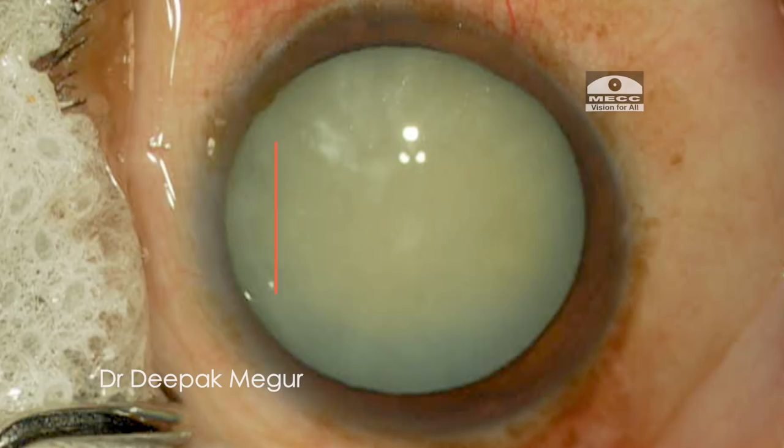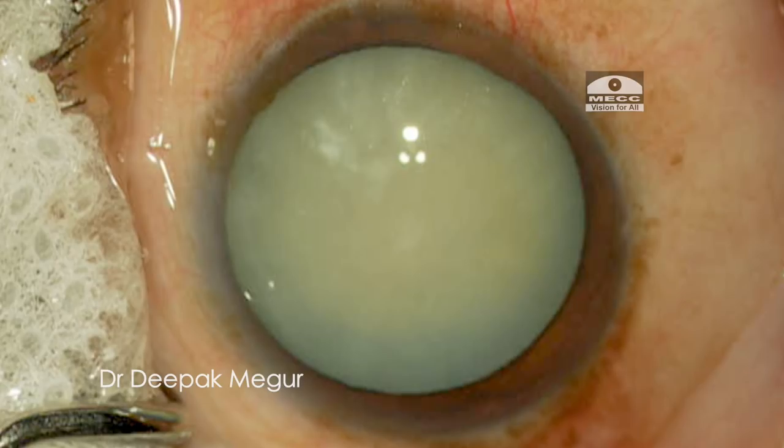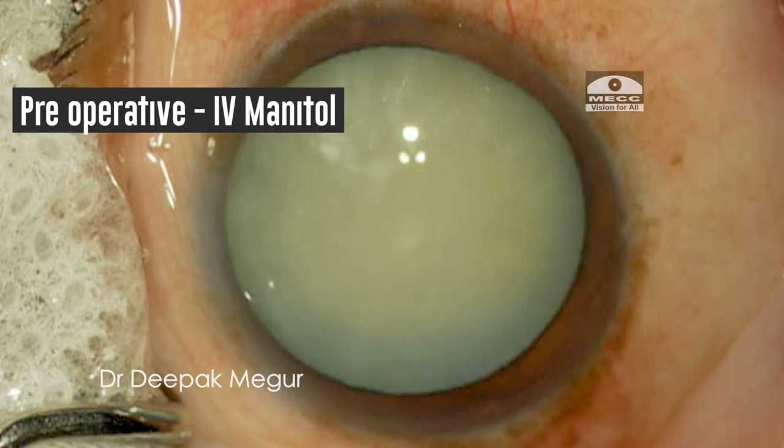This is a 45-year-old lady with an intumescent cataract. In this case the anterior chamber is very shallow, and we have used pre-operatively IV mannitol about 300 ml for this patient.